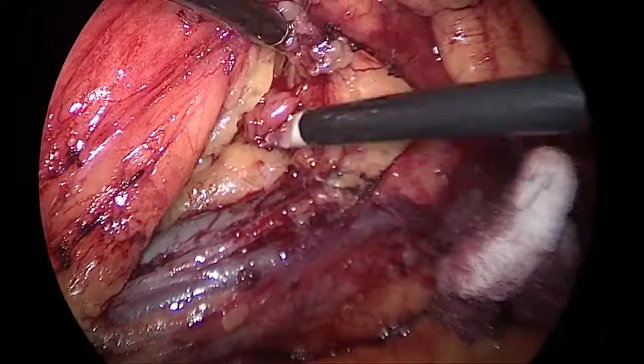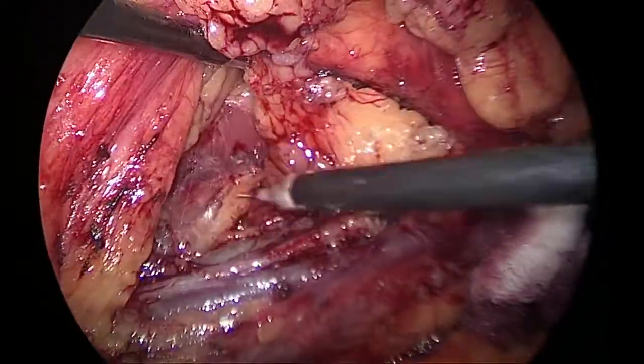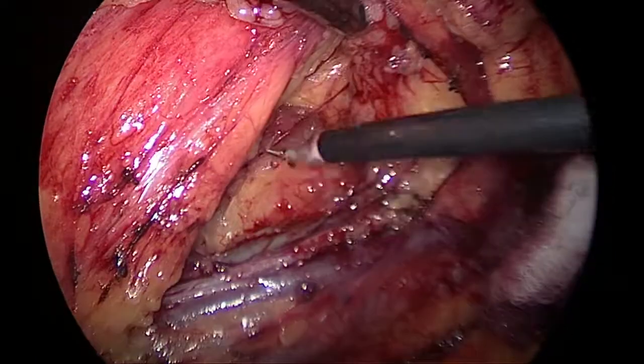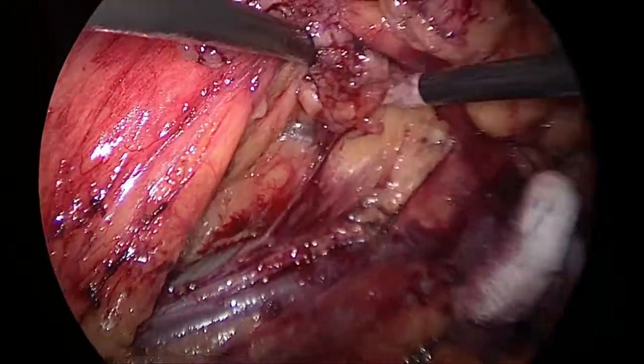I am trying to go to the hilum, but as I left the gonadal vein medially, some fat is remaining attached with the psoas muscle.